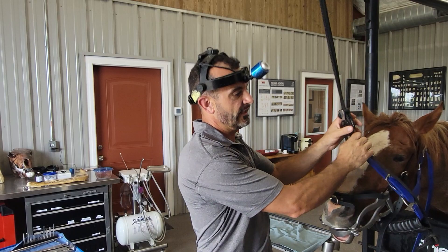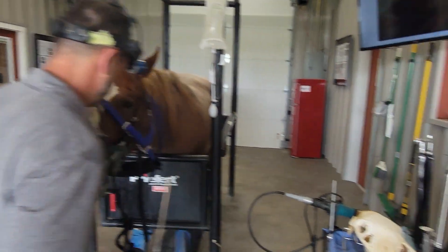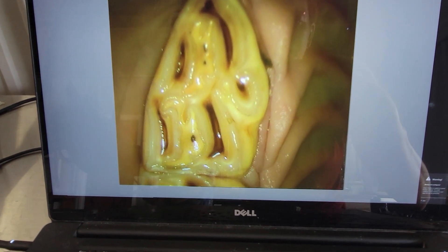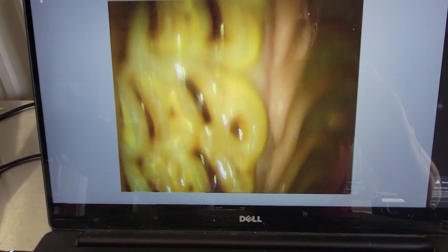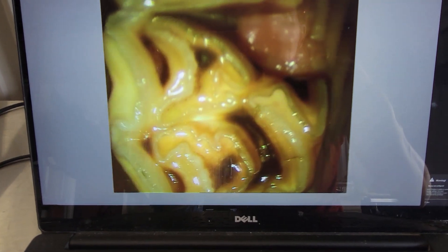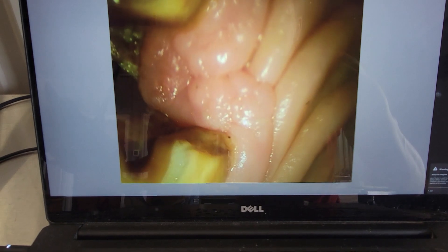I'll put the endoscope in there and give you a quick look. Here we have the 106, that's nice and normal. 107 is totally normal. 108 looks nice and normal. And then we go to 109 and we can see how we have a palatal complicated fracture involving pulps 3 and number 5, and they're covered by granulation tissue.